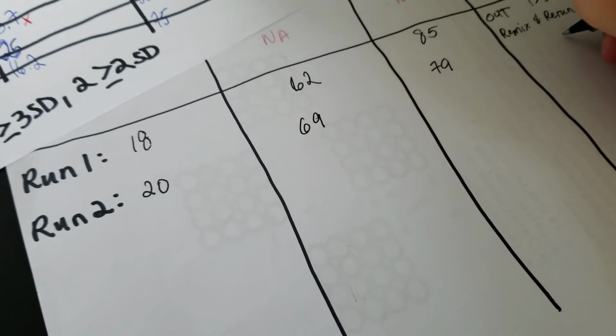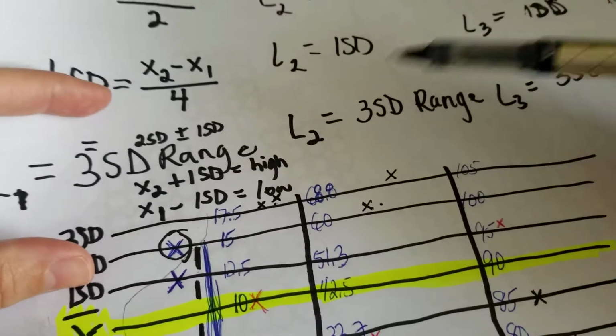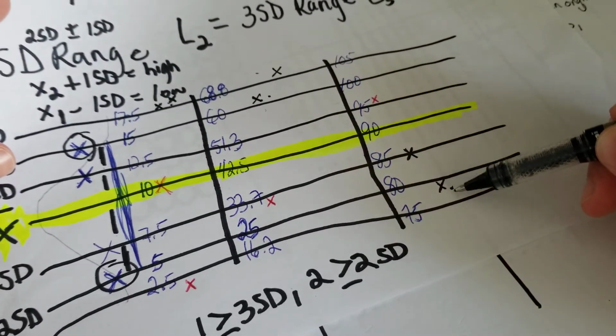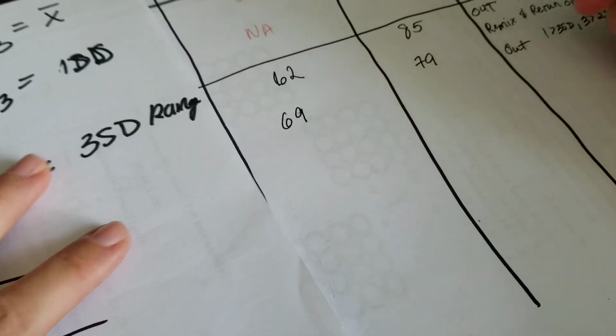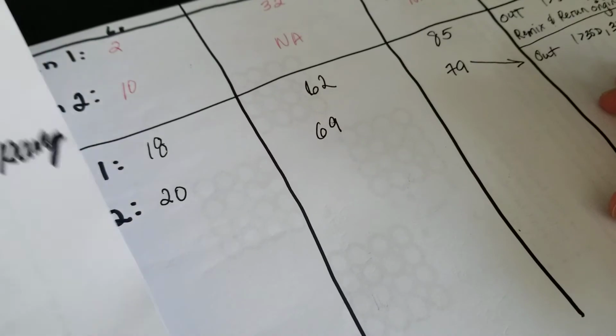We've got 1 greater than 3SD. And we've got 1, 2, 3 greater than 2SD, right? It's greater even though it's below, because greater means outside in this case, outside of that range. Okay, so at this point, we have 3 greater than 2SD. So that's super out, right? We don't like that. These are off the line. Got kind of excited.